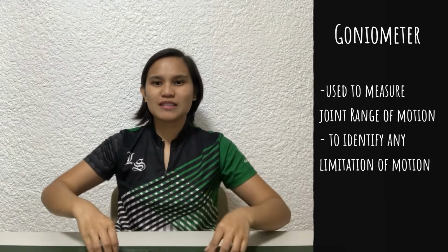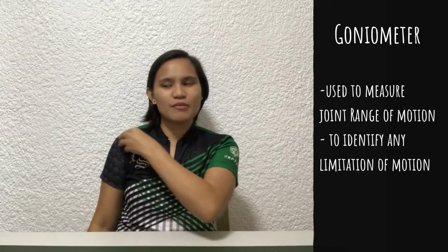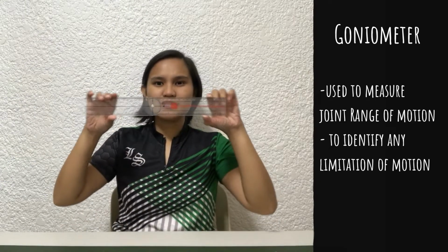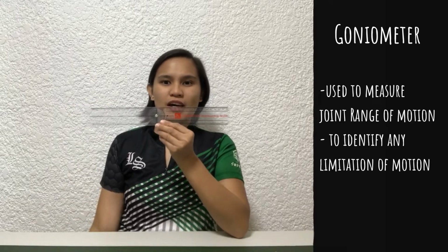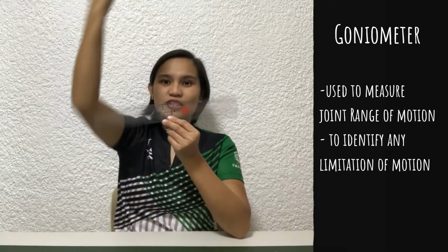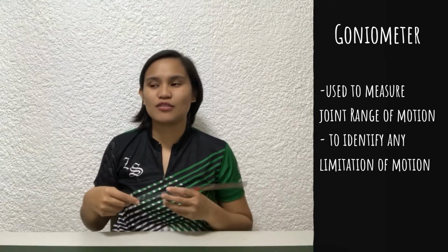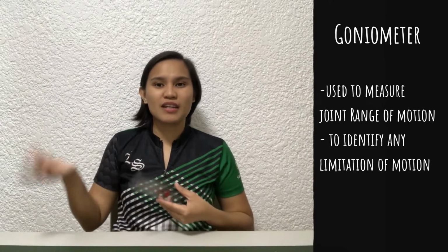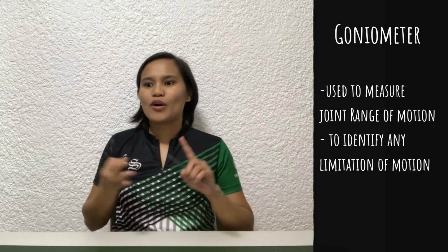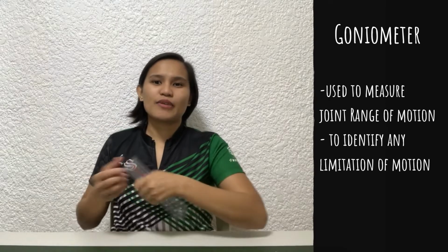We all know that our joints have different degrees of mobility. So, let's say, for my shoulder, I can move it upward. We use the goniometer to measure if the range of motion of a patient is normal or if there is limitation of motion, because once there is limitation of motion, we have to address that limitation, either by providing exercises or providing modalities that would help increase their range of motion.